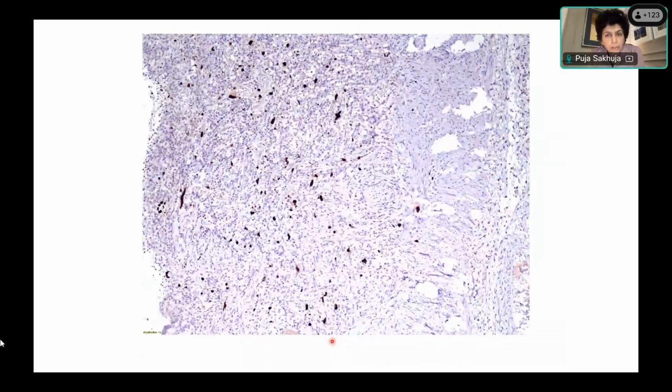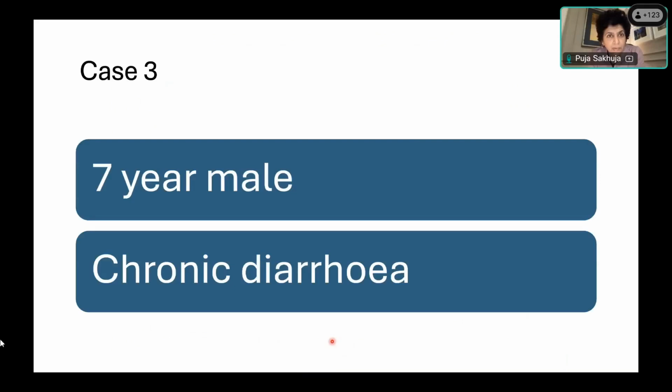So this was a low power picture. It was just teeming with CMV. I've never seen so many CMV before.